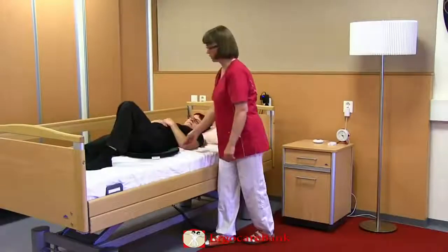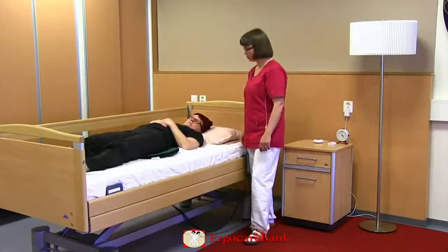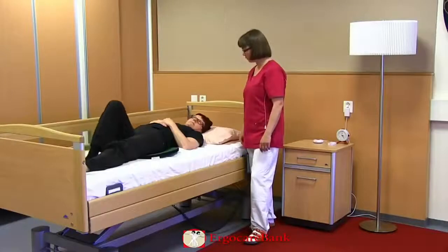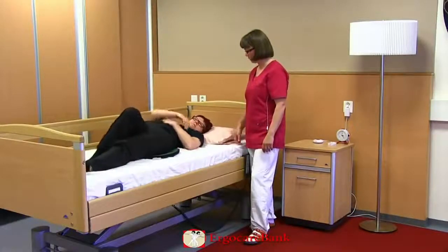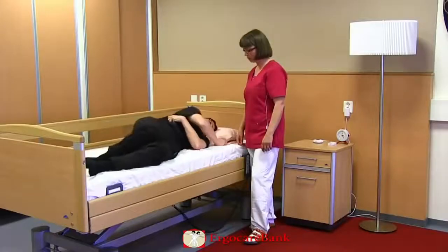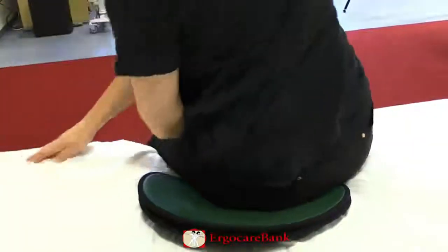Amanda is instructed to bend her right leg, place her arm across her body and roll over. She swings her legs over the side of the bed, pushes off with her arm, and the disc helps her sitting up.